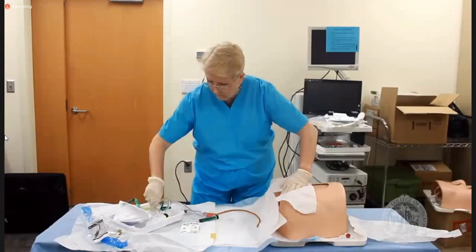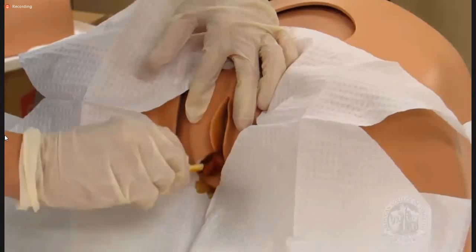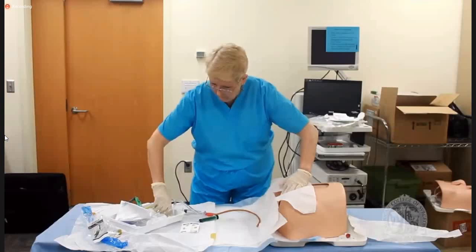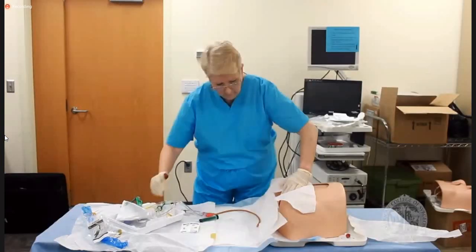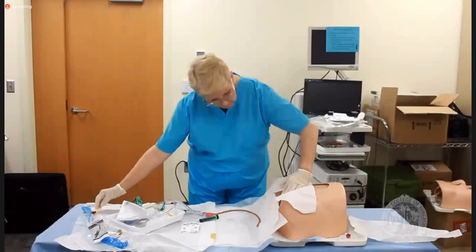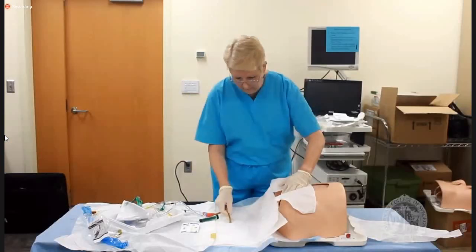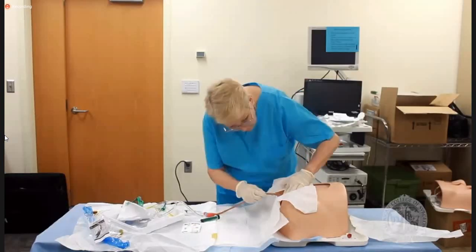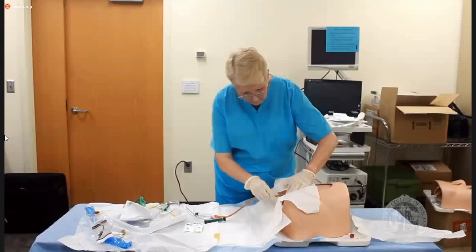Your non-dominant hand is now contaminated and cannot assist in placement until the catheter is in place and the balloon is inflated. Cleanse the periurethral mucosa from the top down toward the vagina using one downward sweep of the prep solution, then discard. Use the next 2 prep sticks to cleanse the left, followed by the right side of the periurethral area. Continue to spread the labia with your unsterile non-dominant hand. Grasp the pre-lubricated catheter and insert the tip into the meatus.